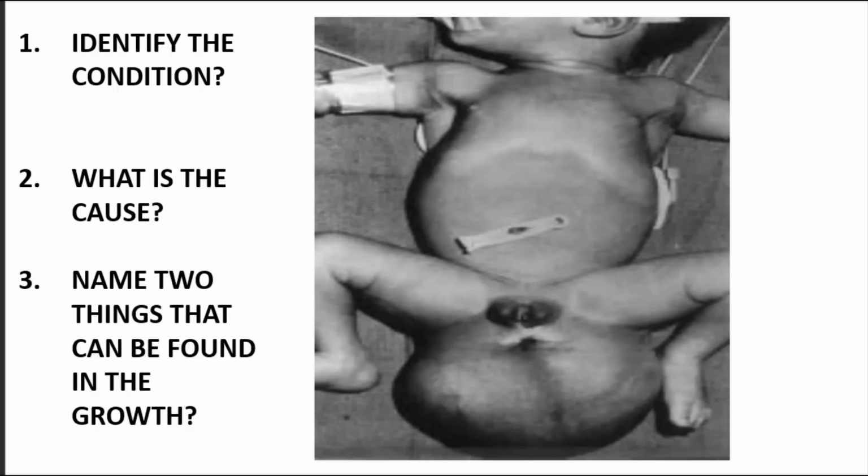Identify the condition. This condition is known as a sacrococcygeal teratoma. This mass here is known as the sacrococcygeal teratoma.